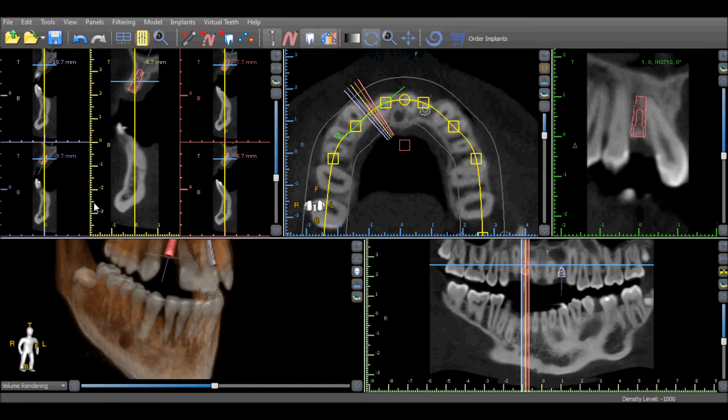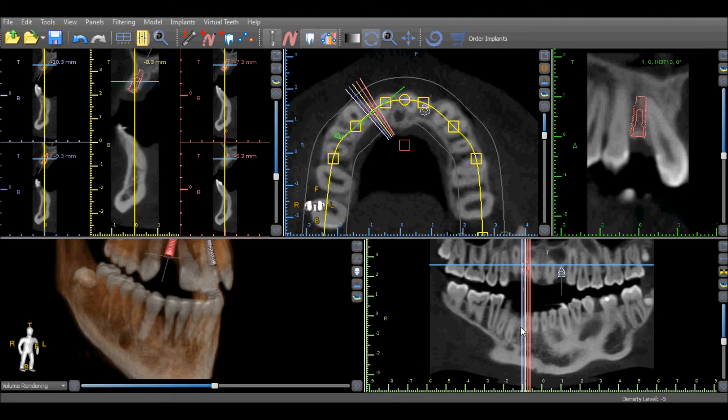Clicking on an implant in any view will make the implant active and center the implant in all of the views, including the tangential view.